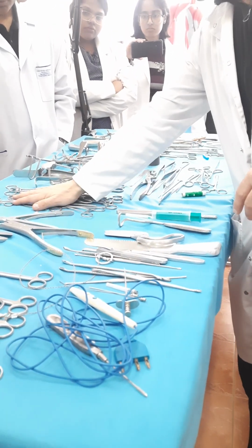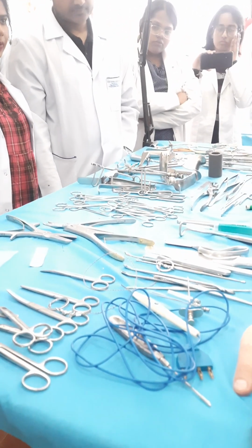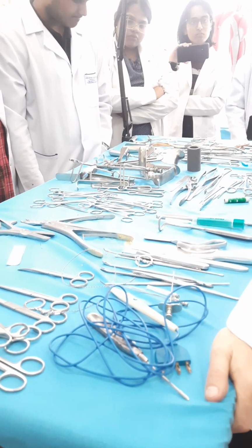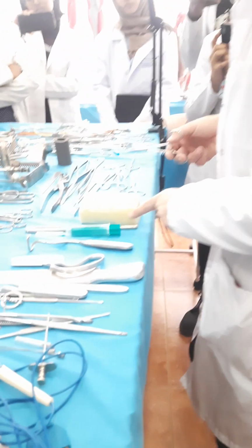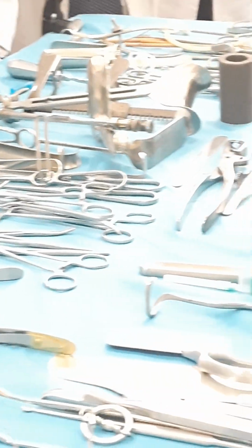Let's continue. Next group of instruments, the second group. We use these instruments, and there are several of them. It is the arterial forceps. What can I do with arterial forceps? Simply, guys, if there is bleeding inside of the wound, for example, let's imagine this red point is the place of the bleeding. I see this bleeding, so I take the arterial forceps and open them. By the way, remember, please, all instruments which have this kind of construction, I use two branches with a block.